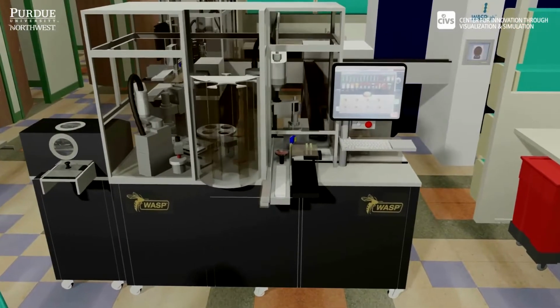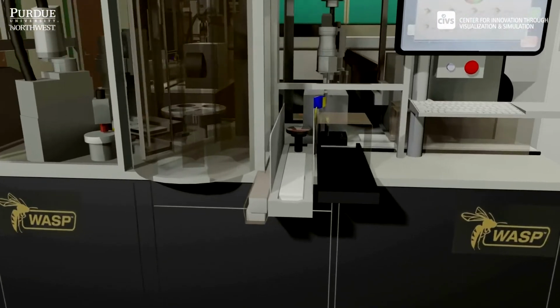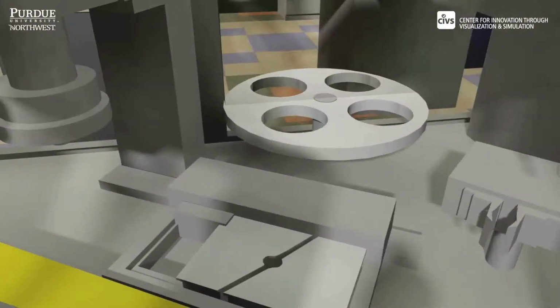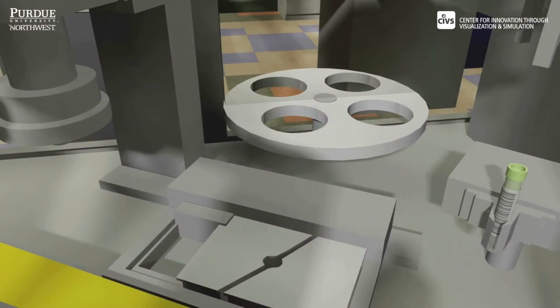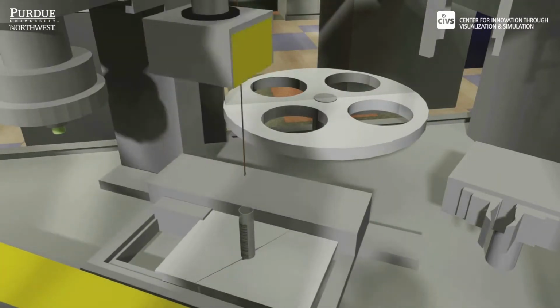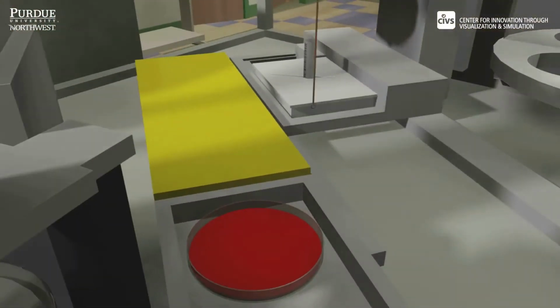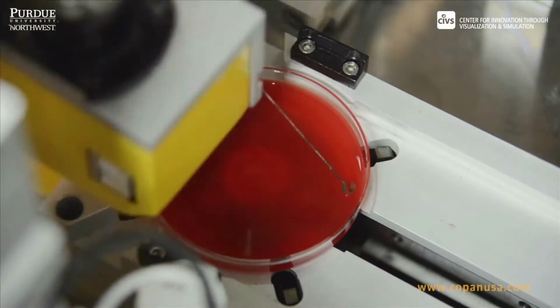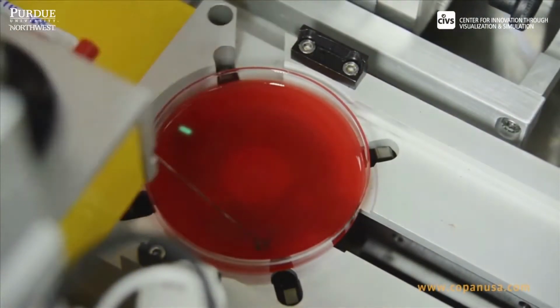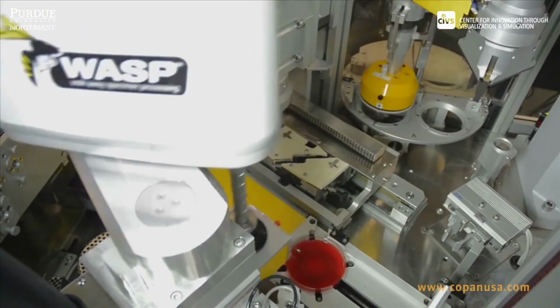The specimen is picked up by a robotic arm to scan the barcode, which retrieves vital information about the test from the lab computer base. The next stop in the instrument is where the specimen is mixed and the cap is removed. Another robotic arm dips a sterilized wire loop into the specimen and transfers a specific amount to different types of media plates. These are streaked in a specific pattern to spread out any bacteria present.